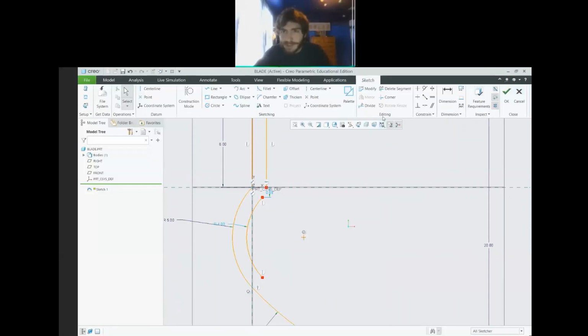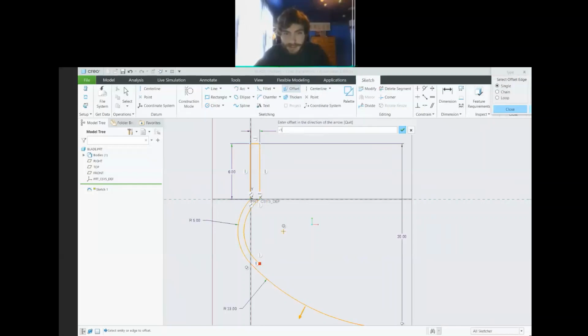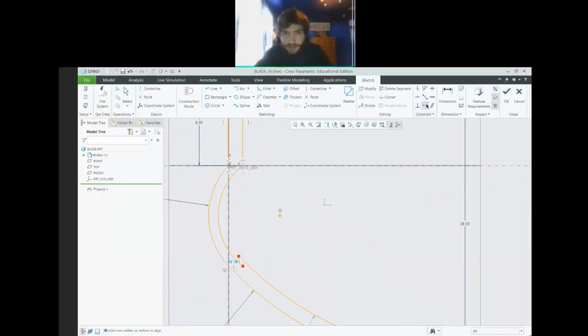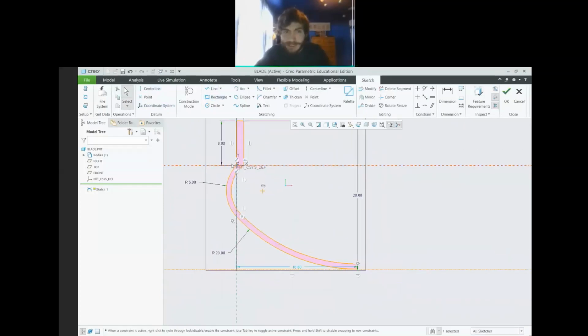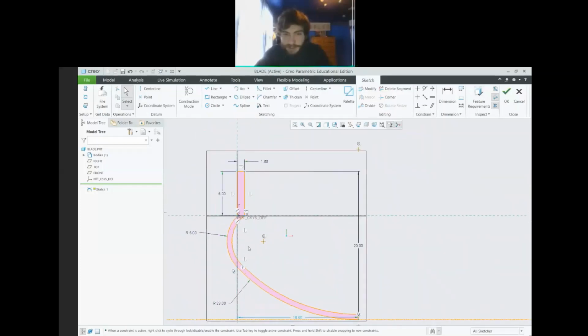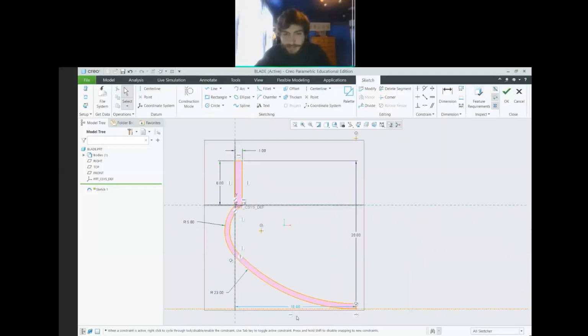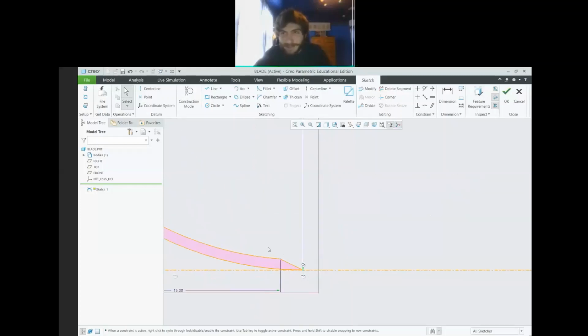So what we can do is see if we could coincident them. Yeah, that'll be fine. And we'll do the same thing. We'll offset this one by -1, and coincident them. We'll draw a line here at the end to complete the shape. Now that it turned pink, it means we have a complete shape, like all the perimeter of it is done. It doesn't seem to be yelling at me for any reason. Oh, this one is still one dimension we could do. I think this is going to make, yeah, okay.